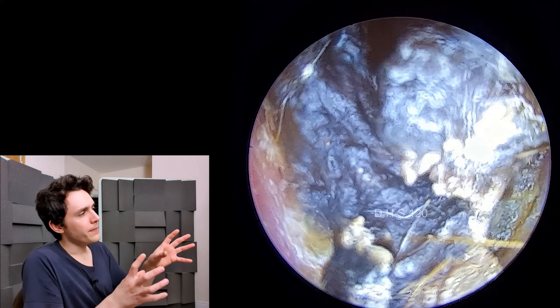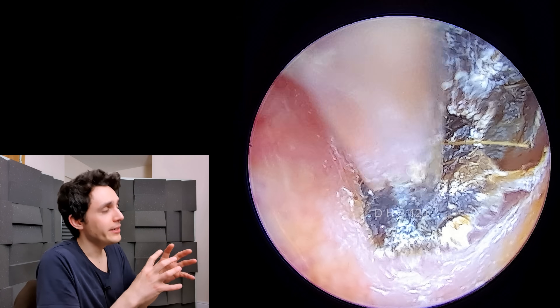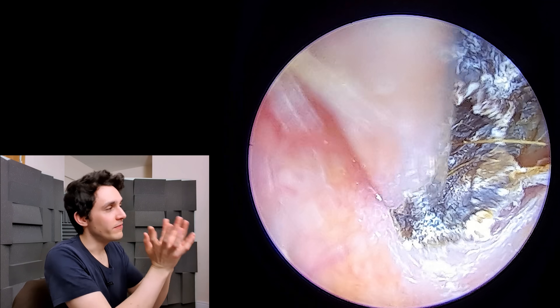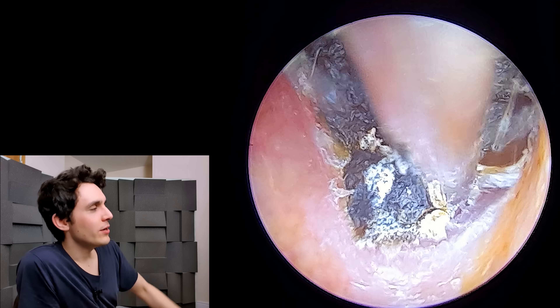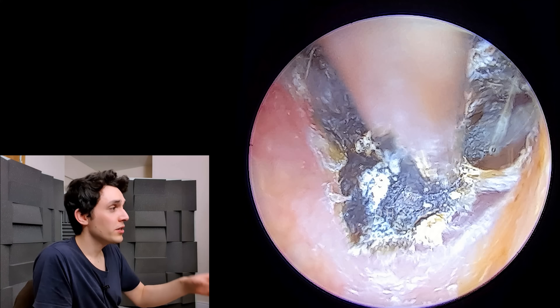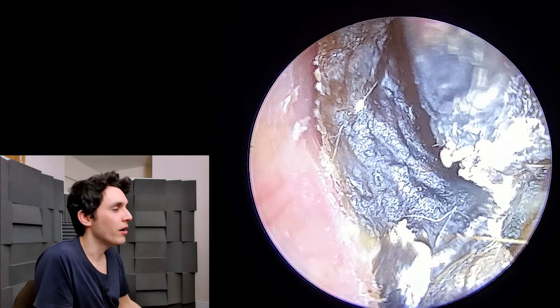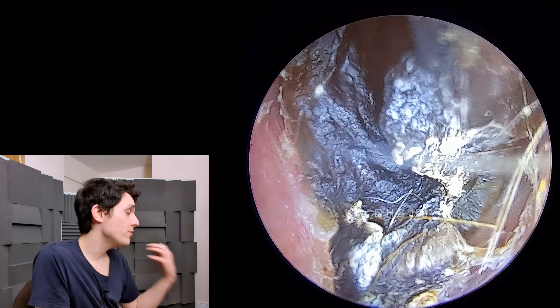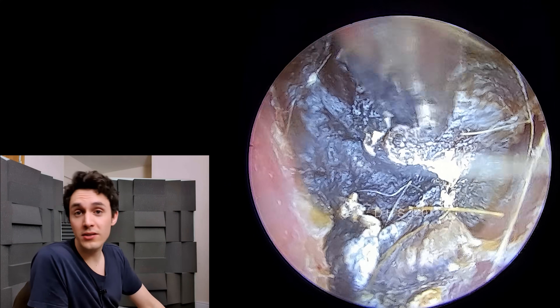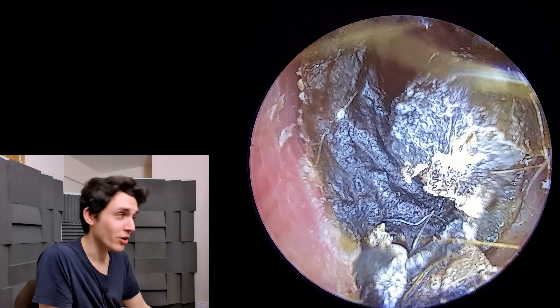Now normally I wouldn't really remove this debris — it's clearly not blocking the ear canal, it's in a nice v-shaped configuration with a gap in the middle. To remove this debris, which is very clearly adhered to the ear canal — very dry and crusty and hard — is going to be a difficult job. Normally I would say to the patient, use some olive oil for five or six days and it'll come out, and if not then I can go in and suck it out and it'll be an easy job.